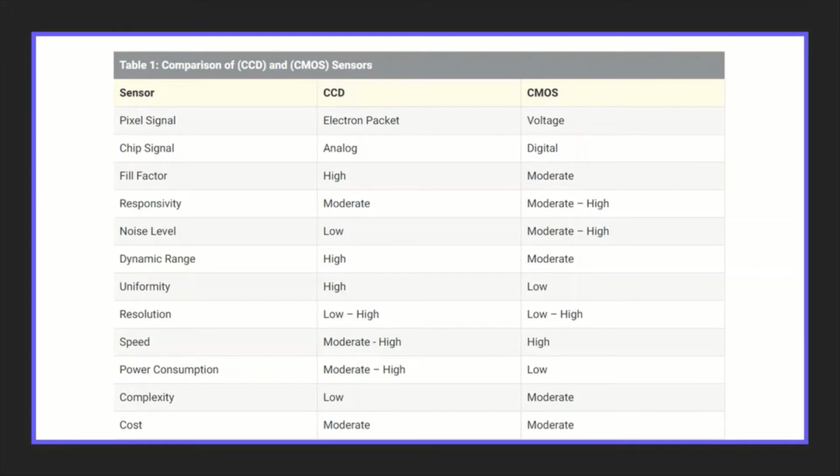But on the other hand, CCD has some disadvantages like CCD frame rates are slower, they require more power dissipation, and they cost more to manufacture and integrate than CMOS. CCD sensors are using dedicated processes with a much slower innovation cycle.